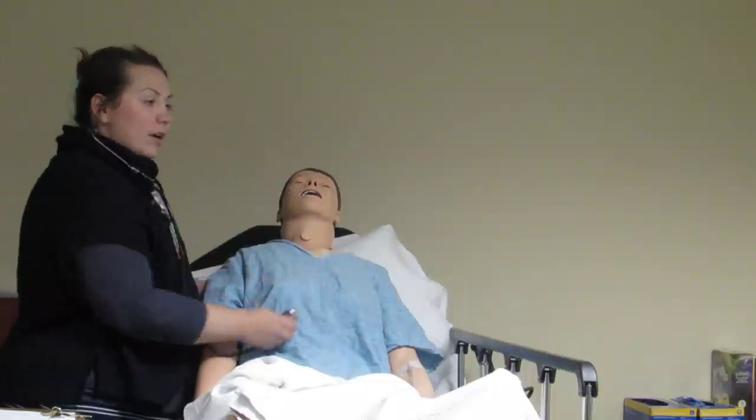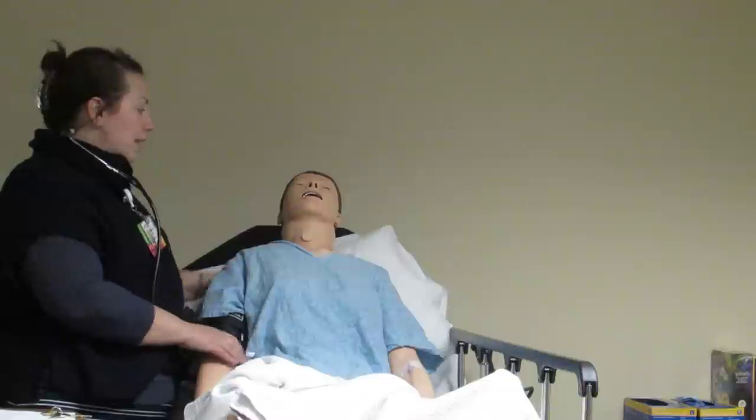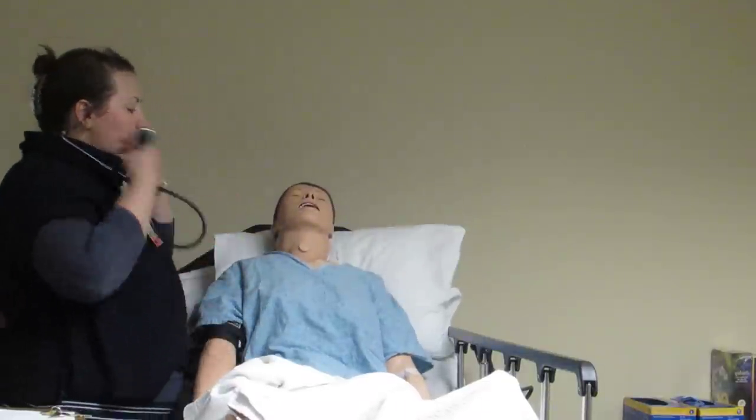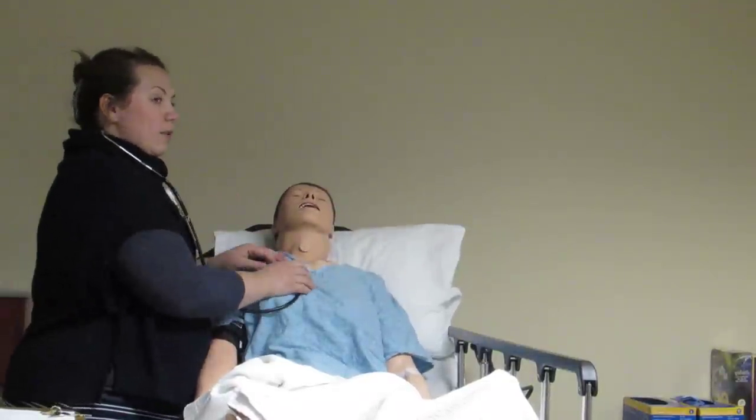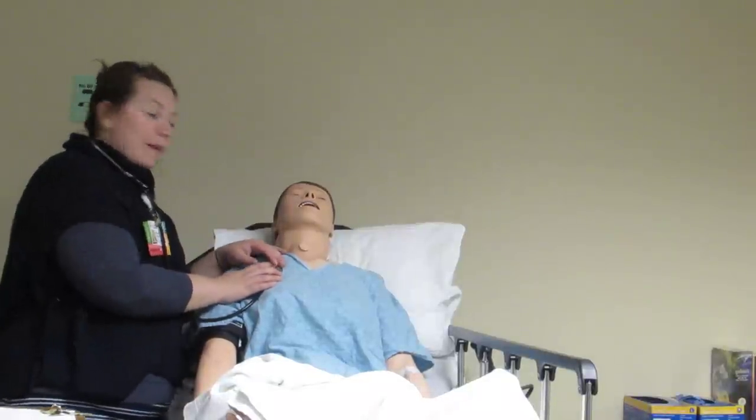The back of the chest is where you're going to hear the best lung sounds. You're going to hear the lung fields completely on the back. So after I'm done listening to the front of her lung sounds, you may need to give your patient a break in between that. It's a lot of breaths for them to take.